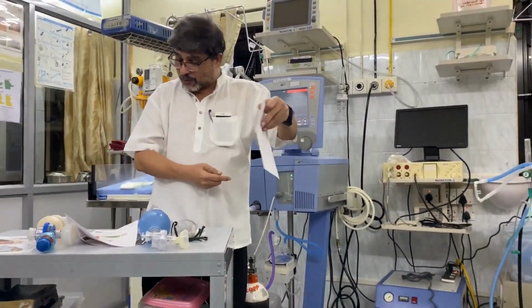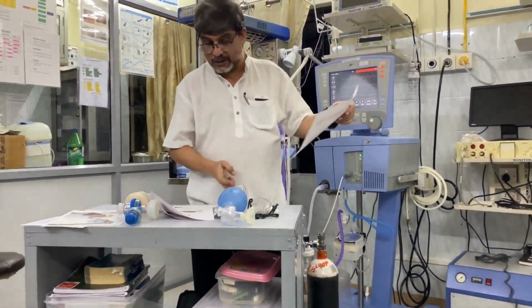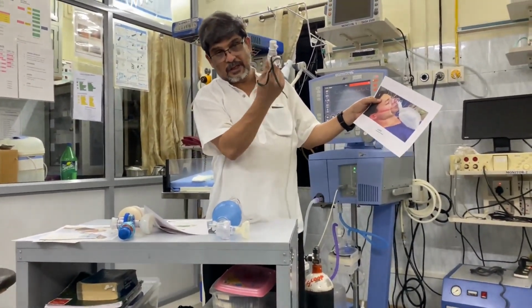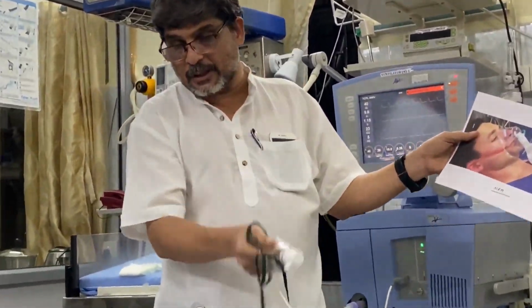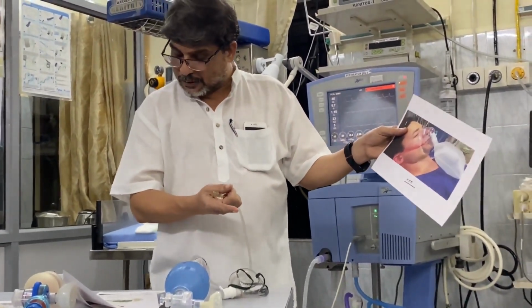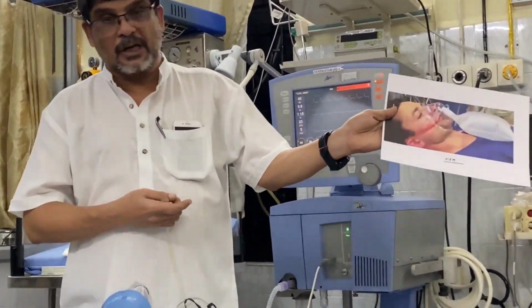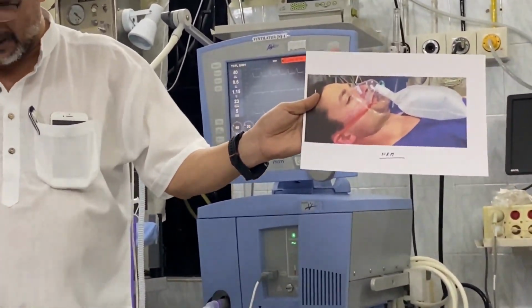The percentage of oxygen which you can get by non-rebreathing mask is almost 95%. So the simple mask will give you 35 to 60%, Venturi will give you about 25 to 60%, and non-rebreathing mask will give you 90%.